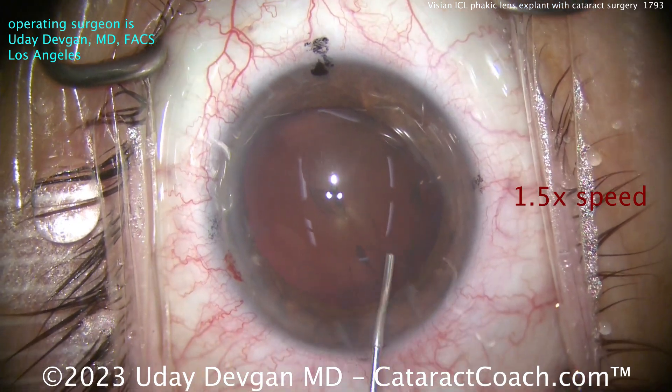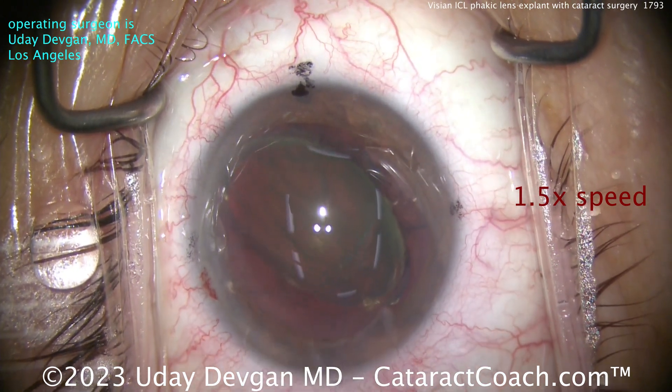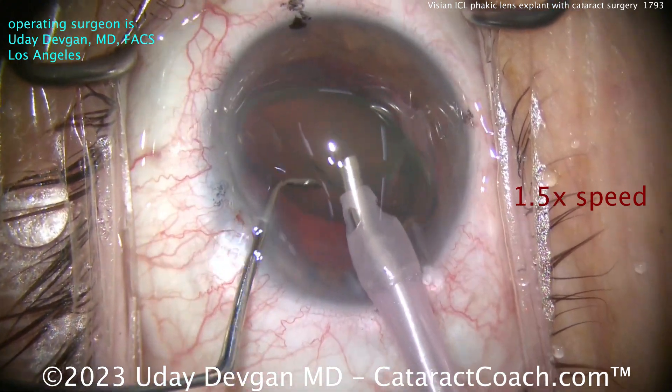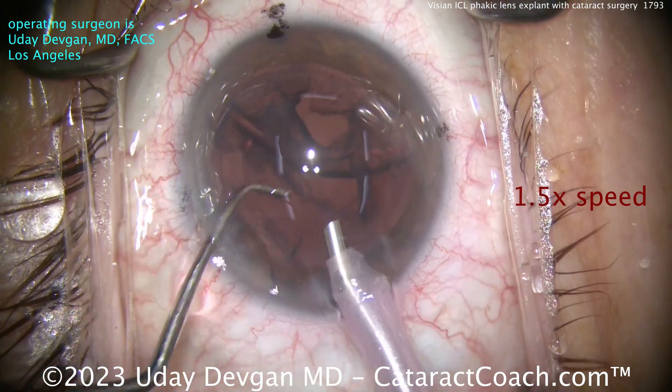We'll do some hydrodissection here. In case you're wondering, the preoperative biometry is pretty straightforward. You can use optical methods such as your IOL Master, your LensStar, or other devices from other manufacturers. As long as it's optical, it's going to go right through that ICL and give you an accurate axial length.